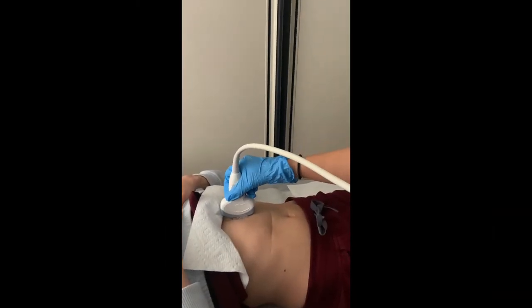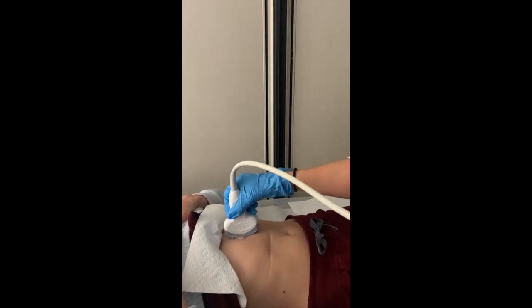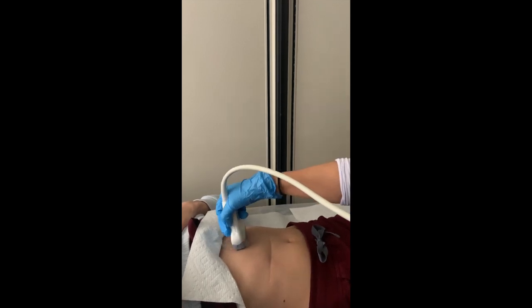Demonstrating a few techniques using the transducer: you can fan the probe, use a heel-toe motion. Likewise, you can also do these motions in the transverse view.